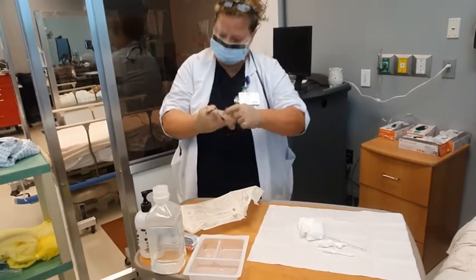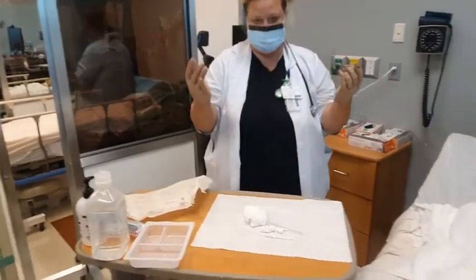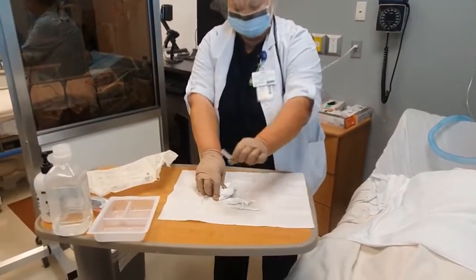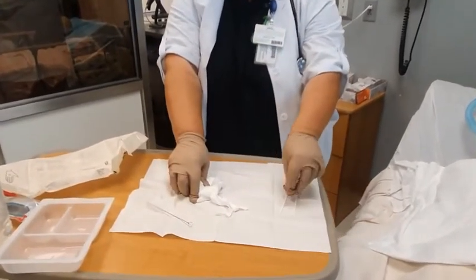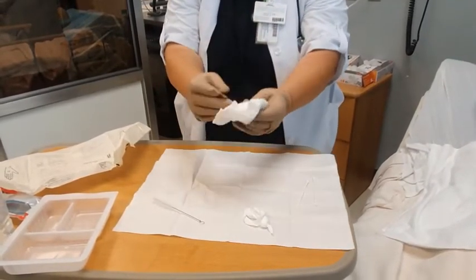So once you get your sterile gloves on, at that point you can arrange your supplies on your tray. Now, gloves are on, you must keep them up. So you want to arrange the supplies so you can put your brush, say, here. Your Q-tips can go here, which you'll be needing. We'll not be using the ties like this. We'll be actually using another tie.